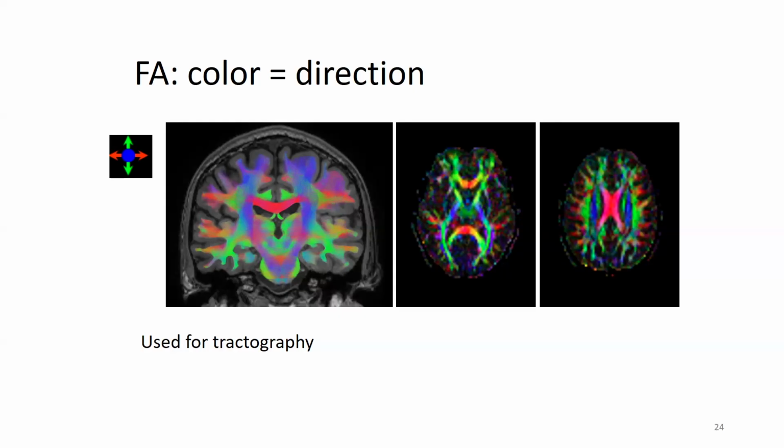So instead of only knowing that I have a certain preference, I can also see what is the direction of my preference of diffusion. And some smart guys thought about this color system. Again, you should not be colorblind. I don't know what people do if they are, because then it's difficult. But this picture is meant for an actual image, so shown here.